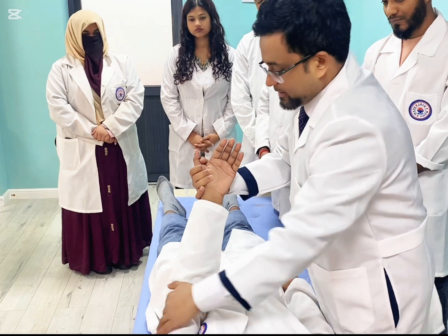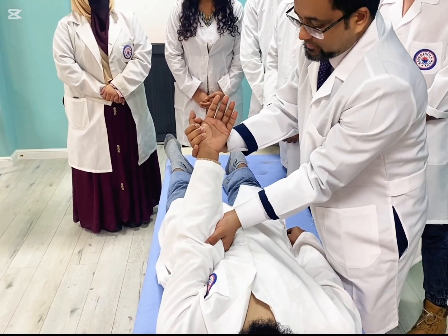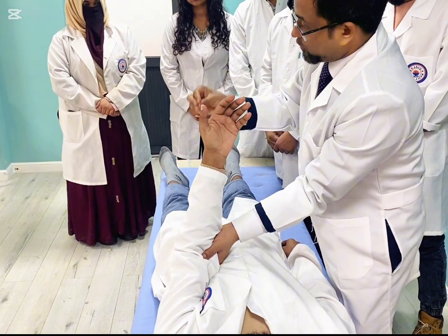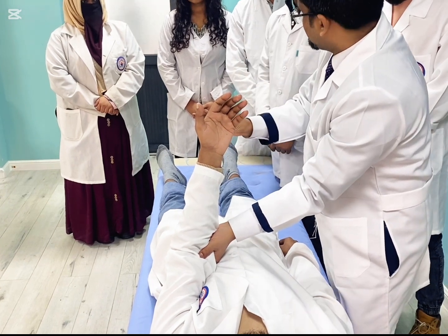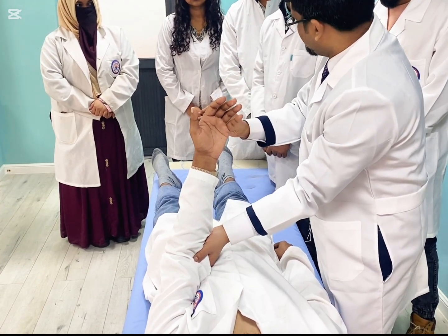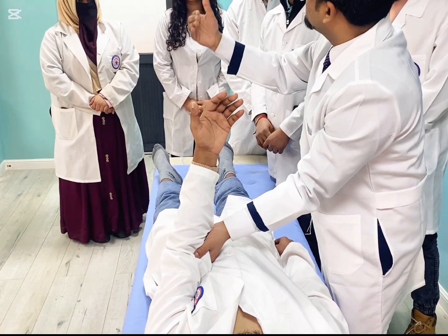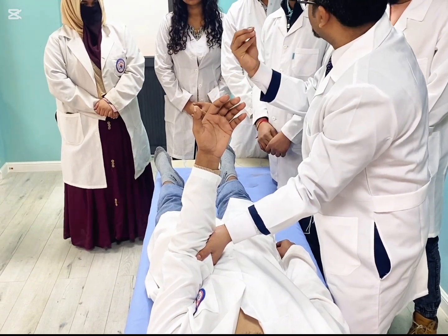Suppose you have tied the cuff here, then you will feel the brachial pulse. You will inflate the cuff. When this brachial pulse disappears, suppose it disappears at 120, then you will inflate the cuff 15 to 20 millimeters of mercury more, like 140 or 145.